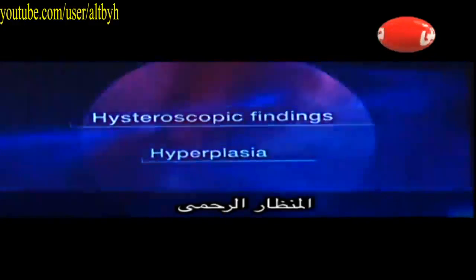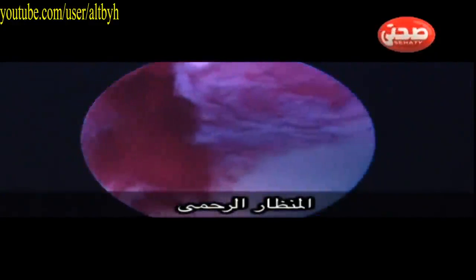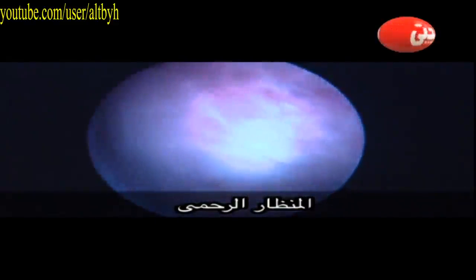Hyperplasia can also be found, especially in ladies in whom you suspect hyperplasia on ultrasound scan, mainly with perimenopausal or postmenopausal bleeding. In this case you can see hyperplasia of the endometrium, and a biopsy is needed to decide further management and whether there's atypia or not.